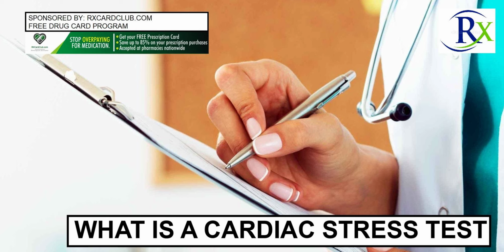An inability to use your legs does not preclude you from getting a cardiac stress test. A bicycle-like crank that you turn with your arms may be provided instead of a treadmill. Stress test by injection may be used if you are unable to exercise because of a physical disability. A short-acting drug, usually regadenoson or adenosine, can simulate the effects of exercise on the heart.